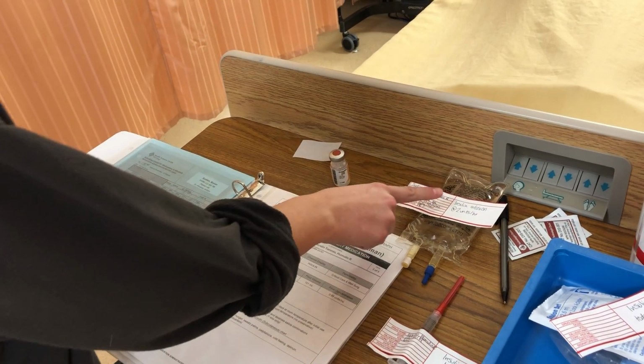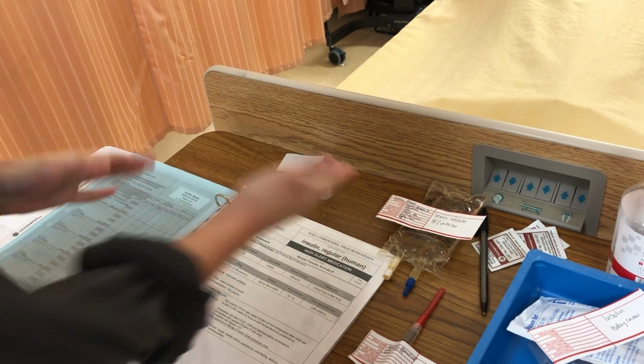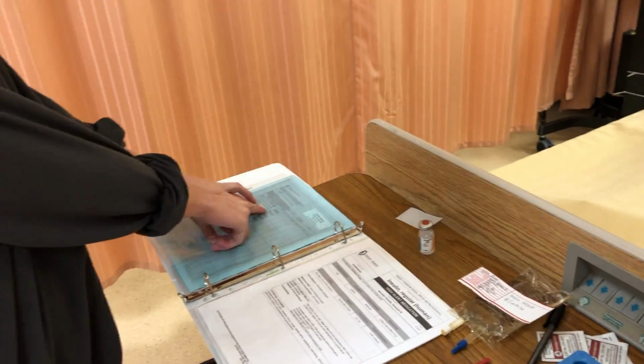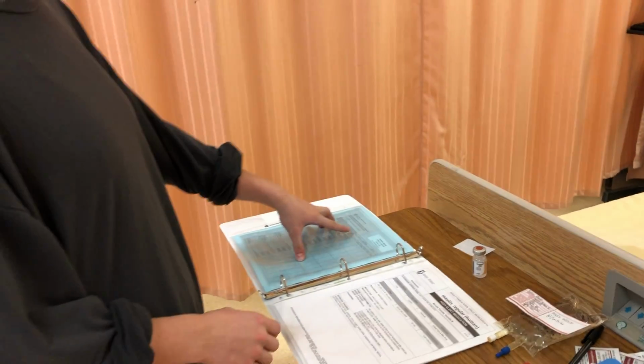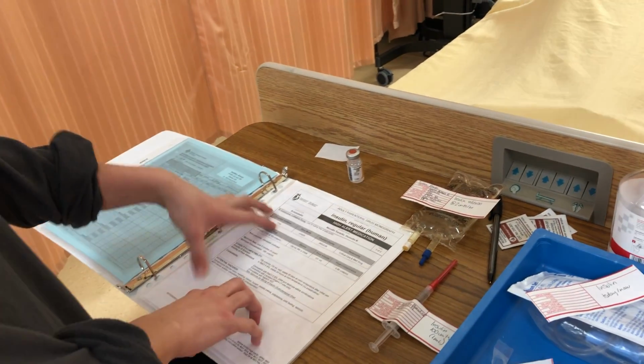We will be injecting it into this 100 ml, so we'll have a final concentration of 0.99 units per ml, and then we'll be running that at 2 units per hour to get our dose. Our route is, it's been ordered for IV continuous. We've gone over the PDM for IV continuous.